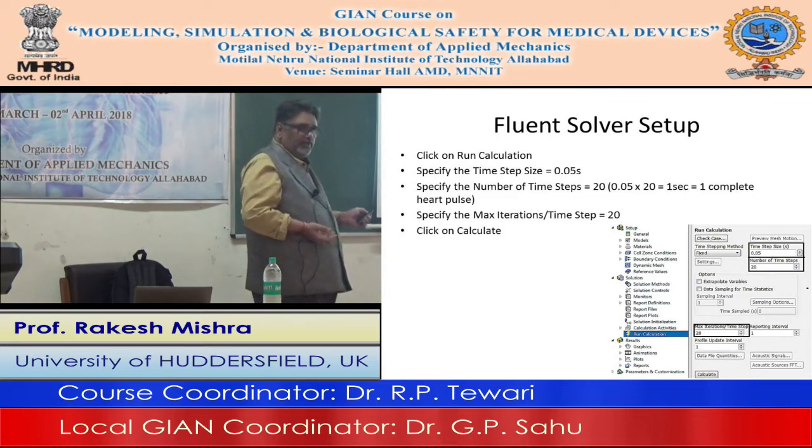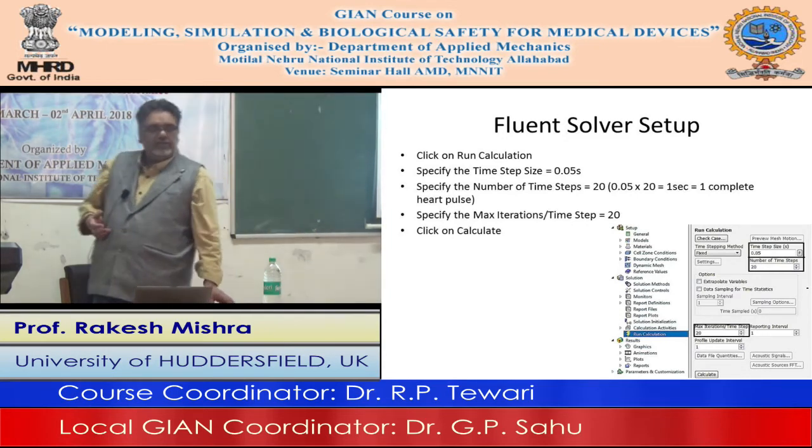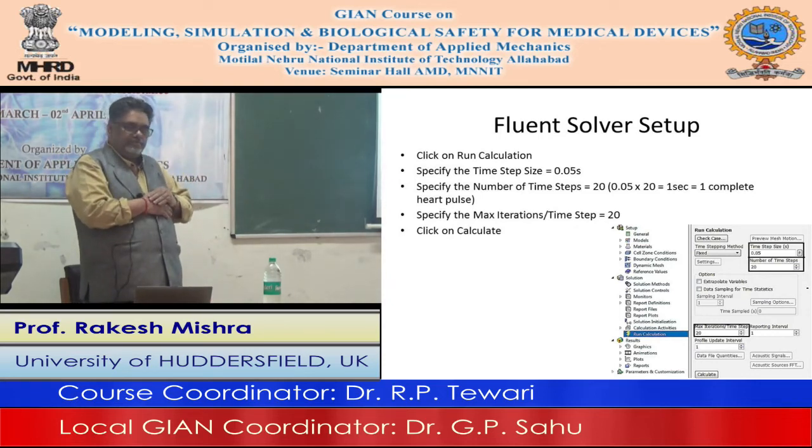And then we click on calculate. So this way you can import the transient boundary condition at the inlet and you can set the system for the transient run. Okay, any questions on this please?